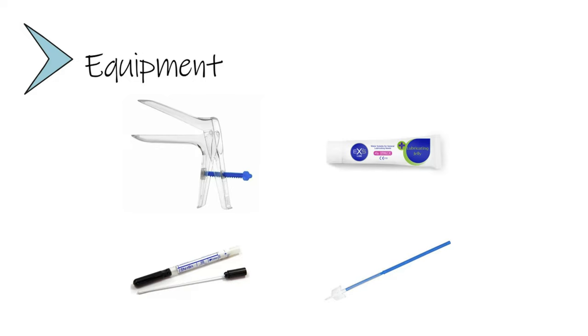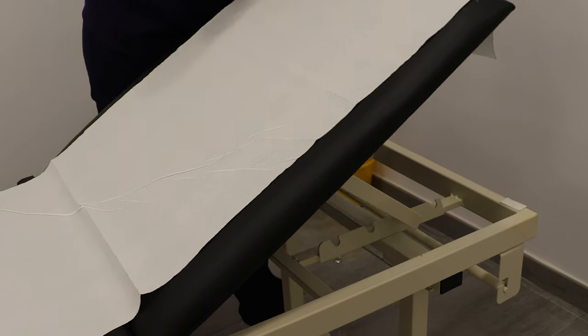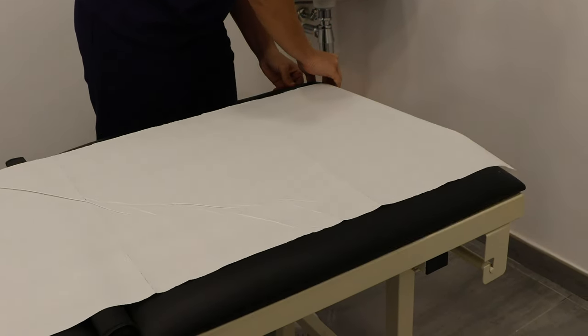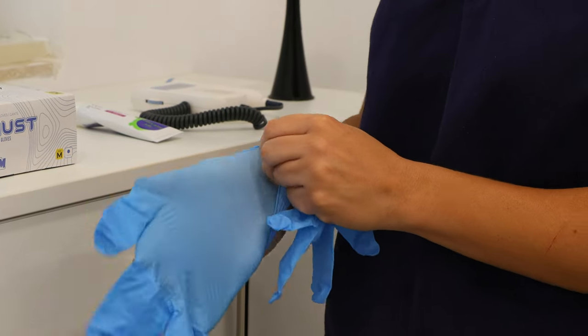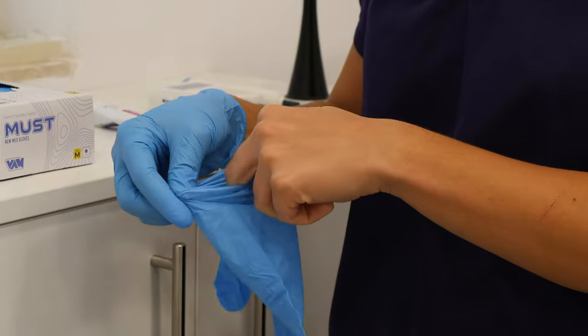We also need to prepare the couch. This time we need to position the couch completely flat. Then we need to make sure we wear disposable gloves, as you can see here.